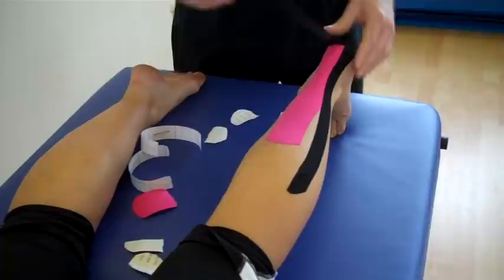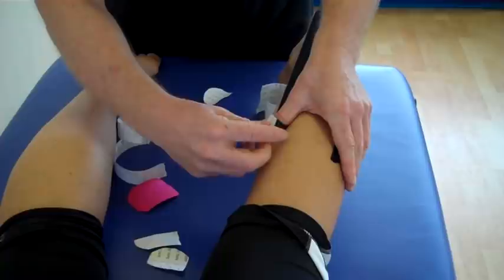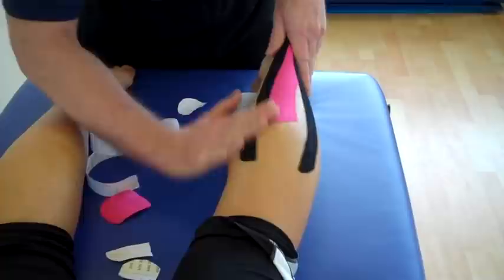And exactly the same for the medial head of the gastrocnemius — 75% stretch along the medial head, and the last bit just literally mold out and apply.